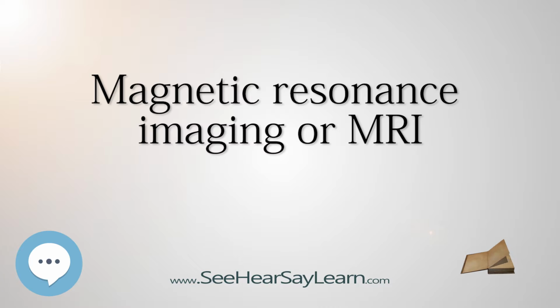Real-time MRI. Real-time MRI refers to the continuous monitoring, filming, of moving objects in real time. While many different strategies have been developed since the early 2000s, a recent development reported a real-time MRI technique based on radial FLASH and iterative reconstruction that yields a temporal resolution of 20 to 30 milliseconds for images with an in-plane resolution of 1.5 to 2.0 millimeters.